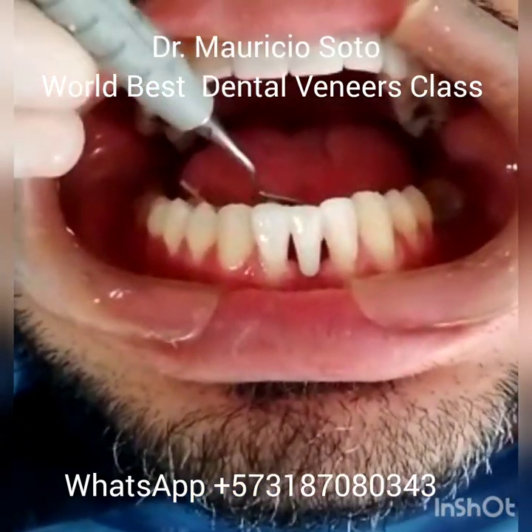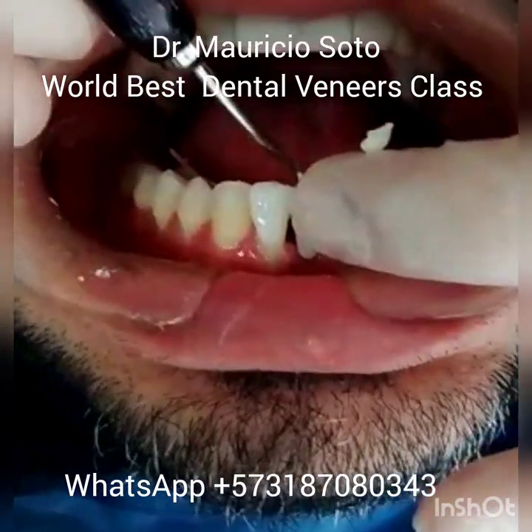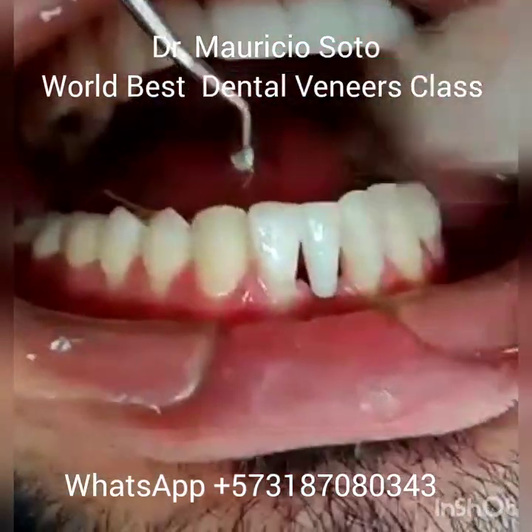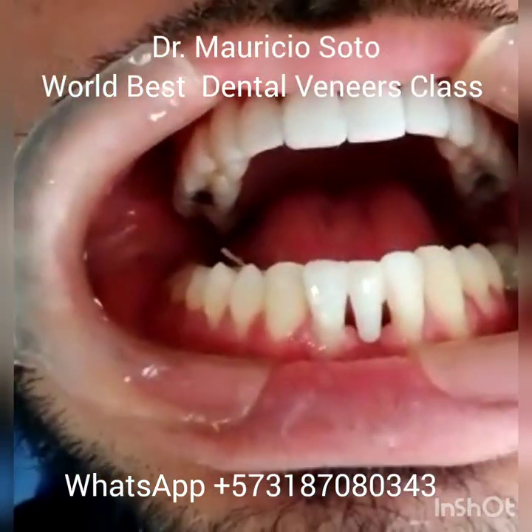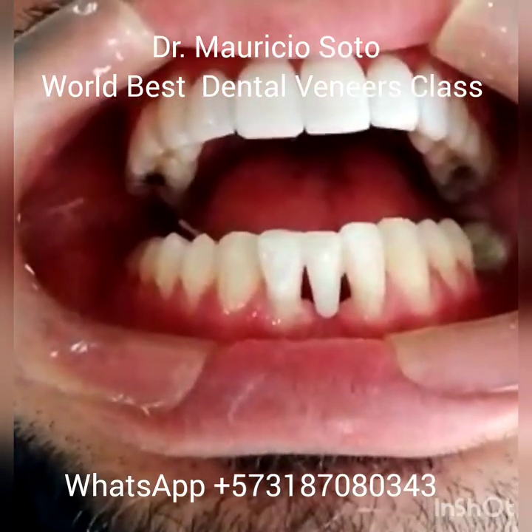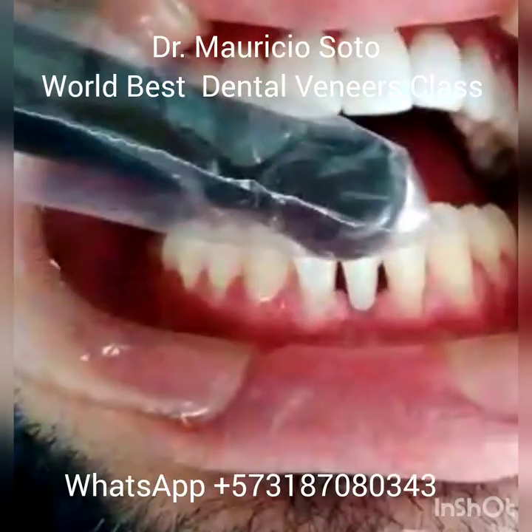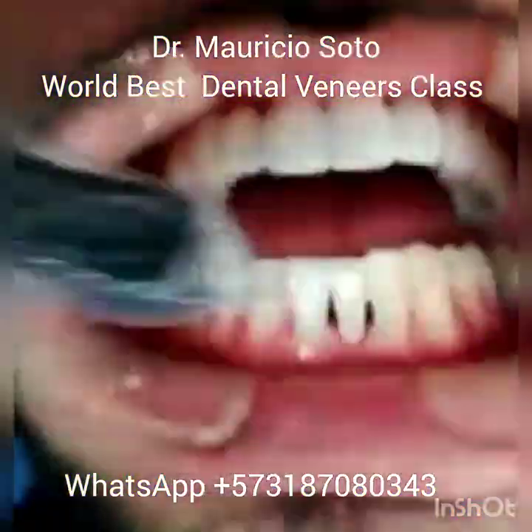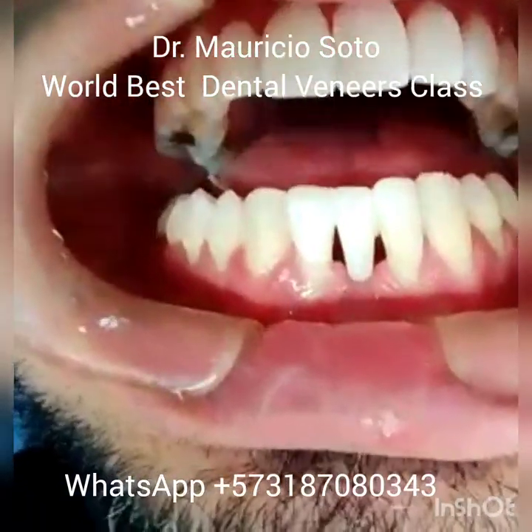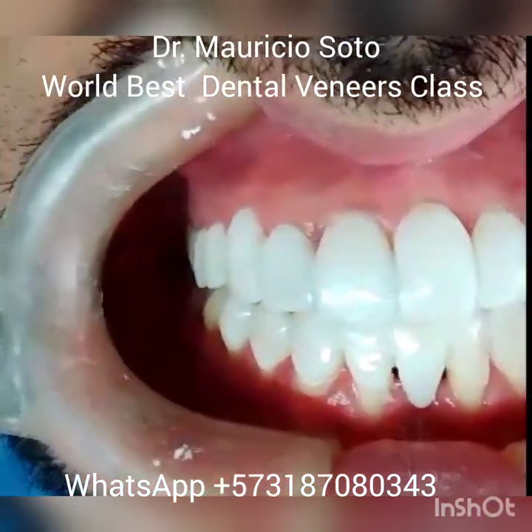When you think the position is okay, it's time to harden the composite to fix the position. With the spatula, I adapt the composite to the back side of the teeth. The position is ready. Check the bite to avoid heavy contact between the teeth. You are ready to harden the composite and fix the position — and now you have a new fixed tooth replacing the missing tooth in just a few minutes, in an easy way.